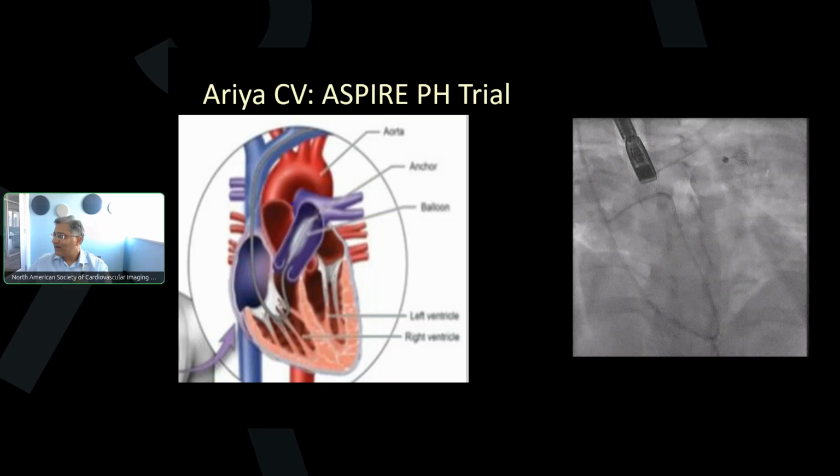And the function of that is that when there is systole, the normal vessel expands, and at that time, this balloon will collapse because of increased pressure. So it allows flow to go across the pulmonary artery, and during diastole, this will inflate and then maintain pulmonary flow.